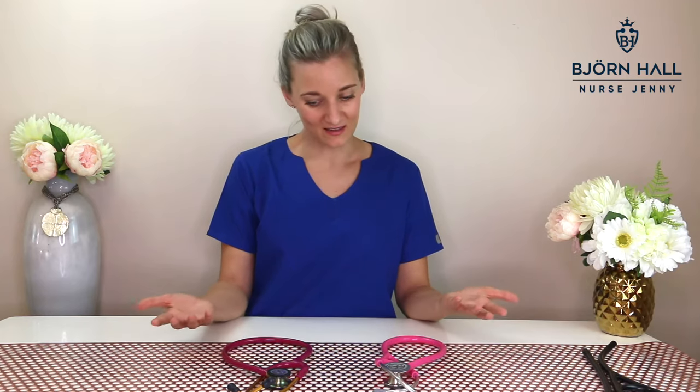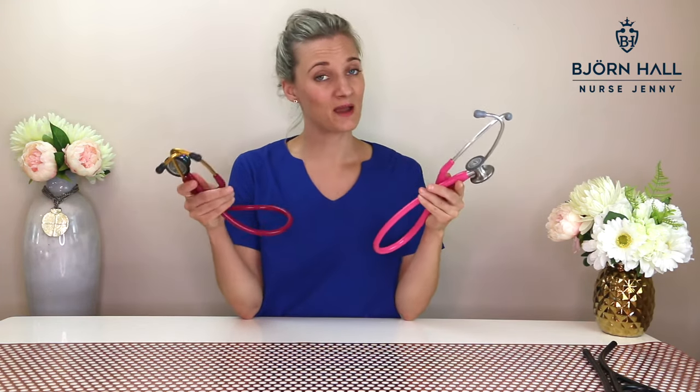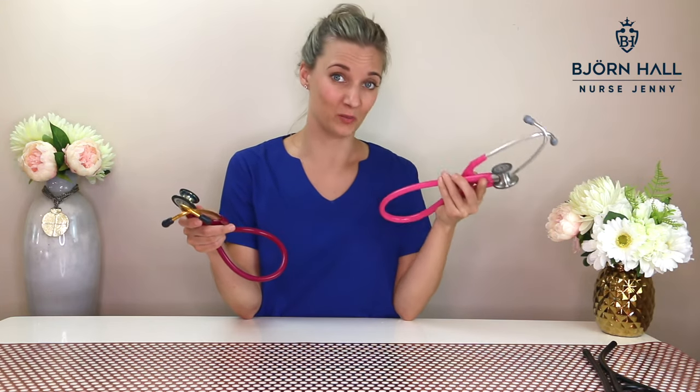So which one should you buy? It's going to come down to personal preference and how much money you want to spend. These stethoscopes are both really good — essentially the Classic 3 can do what the Cardiology 4 can do, and vice versa. But consider this: the Cardiology 4 will set you back about $200 US dollars, and the Classic 3 will set you back about $100 US dollars. Are you a first-year nursing student just learning how to use a stethoscope? Do you really need to buy a $200 stethoscope? Probably not.